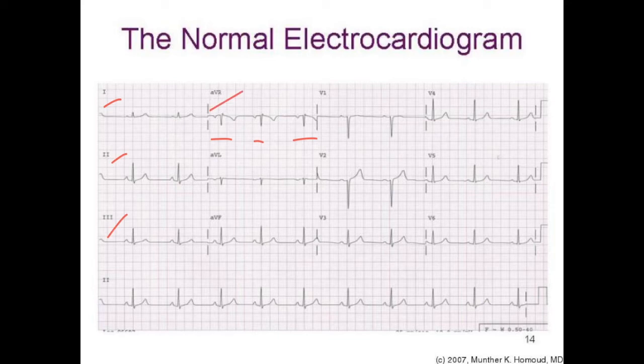You'll have the AVR, AVL, AVF, and you get these from the 5-lead ECG we mentioned. And then if you add the precordial leads, you'll get the 12-lead ECG, which includes V1, V2, V3, V4, V5, and V6. And usually they'll give you a long tracing of lead 2, so you can see what the heart's electrical activity looks like in lead 2 over many beats.